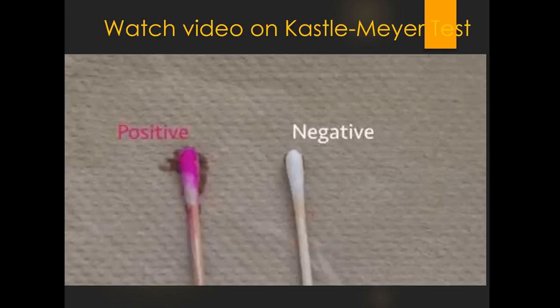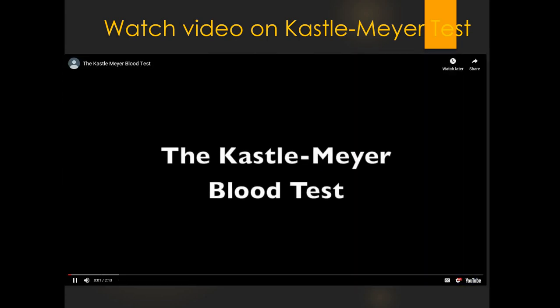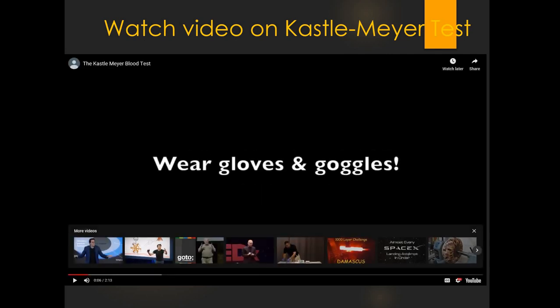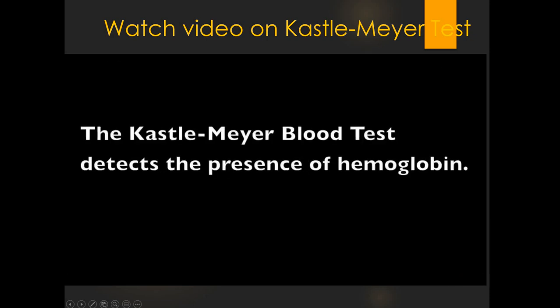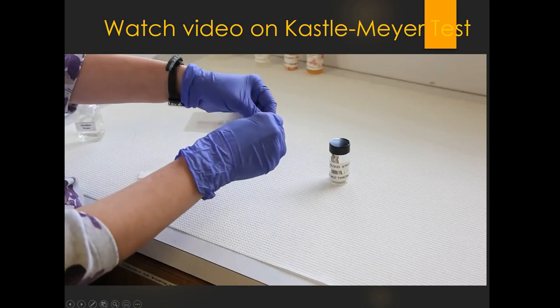Okay, we're going to watch this video really quickly. For this experiment, you will need to wear gloves and goggles. Open a sterile cotton swab.